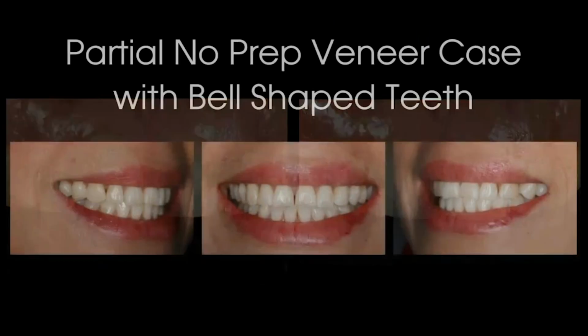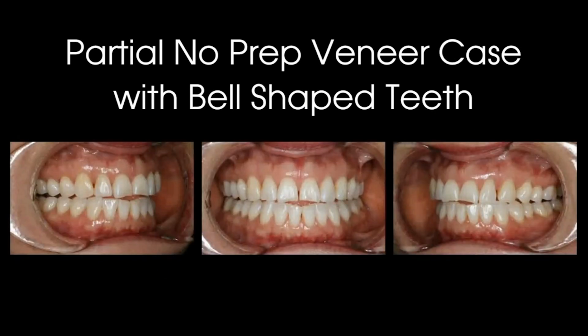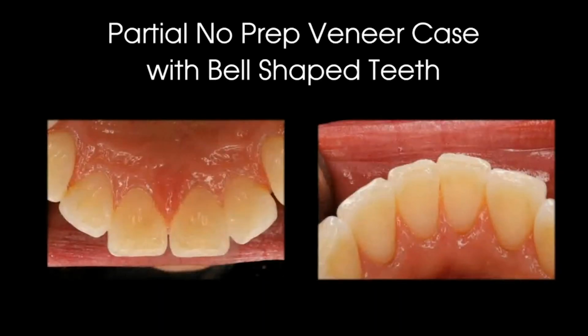Here's another case, a no prep veneer case with bell-shaped teeth in the anterior. And so here's a challenge. She has pretty nice teeth. She's had ortho before, but she's worn out 8 and 9 and 24, 25 on the lower. Just the central incisors, as you can see, they're bell-shaped, so it'd be hard to do a no prep case because you'd leave it open at the gum line. And if you were to prep it, you would cut a lot of the natural tooth away because she's not missing that much. So that's what they look like there.